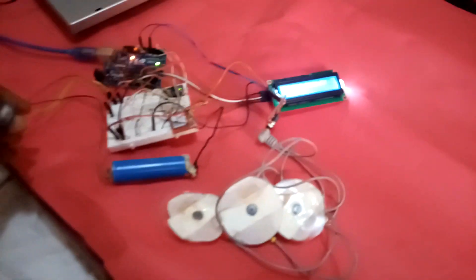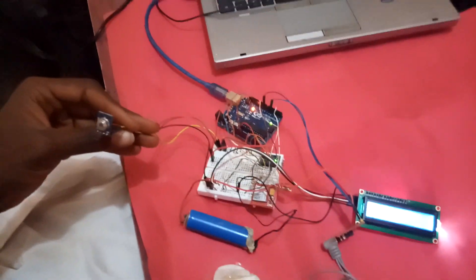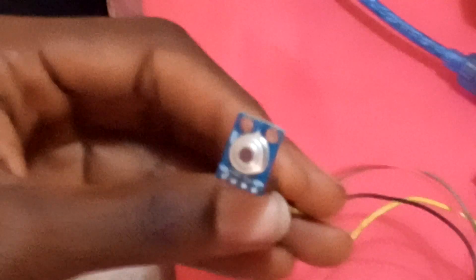Here is the ECG project — I call it the cardiovascular project. This is the MLX90614, a non-contact temperature sensor.